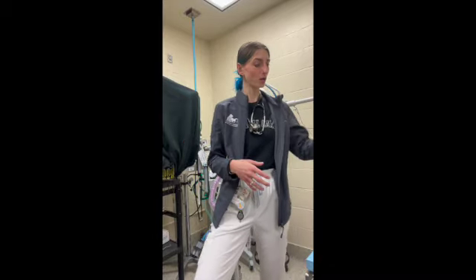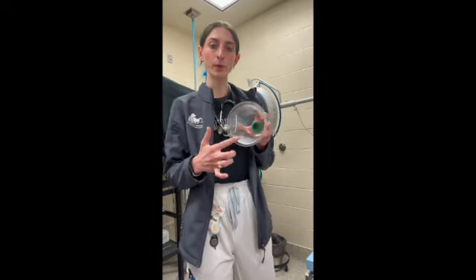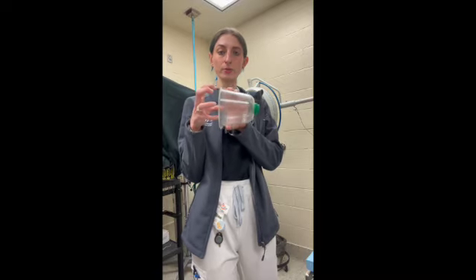So in addition to our rebreathing and non-rebreathing circuits, we also have oxygen masks. Typically they have rings that will go around to help better have a seal around that patient. I unfortunately was having a very hard time locating one. But as I stated, there's typically a rubber black ring that will be placed on the anesthetic mask, and then your patient will just be able to stick their little muzzle in there, and it'll just have a better seal, so that way less of the anesthetic gases are expelled into the room.